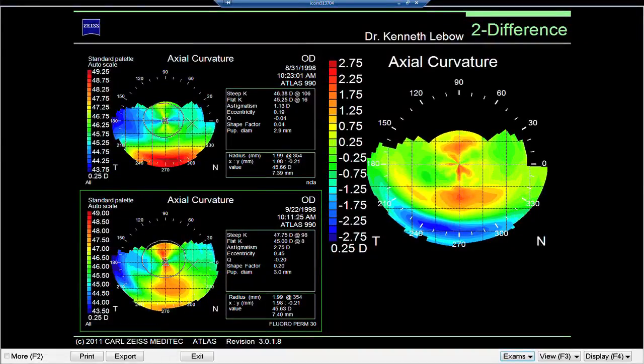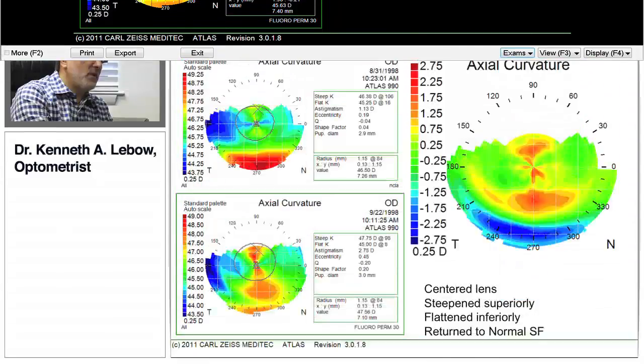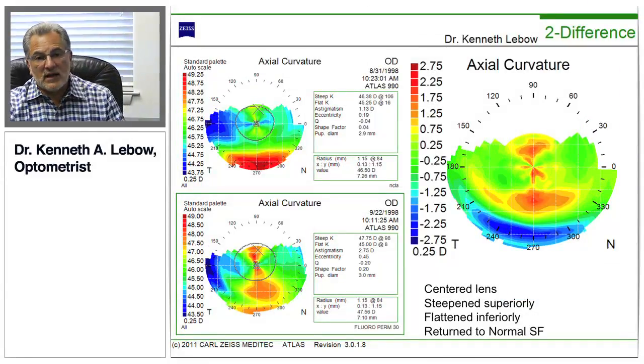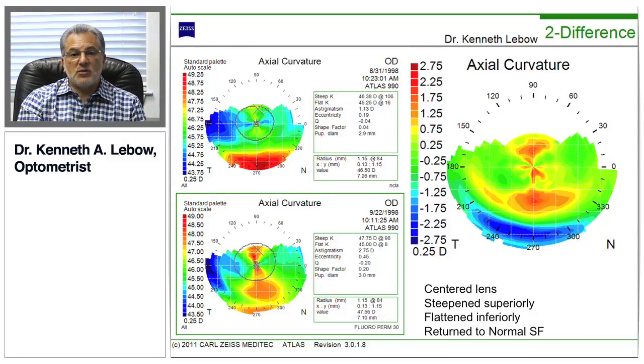Looking at the difference map between the original corneal distortion and the final result of with-the-rule astigmatism, you can see we've steepened the central portion of the cornea in the red areas and flattened the peripheral cornea that was originally steeper. We've taken a very unhealthy contact lens fit and turned it into a much healthier one. Now the patient was able to see better out of her lenses and wear them on a much more comfortable basis.